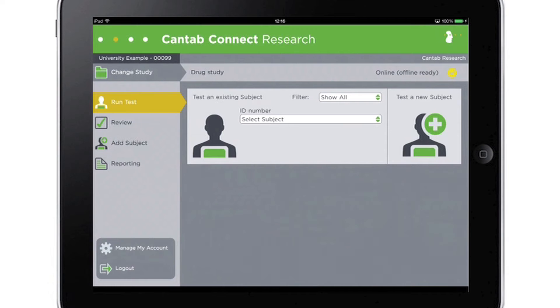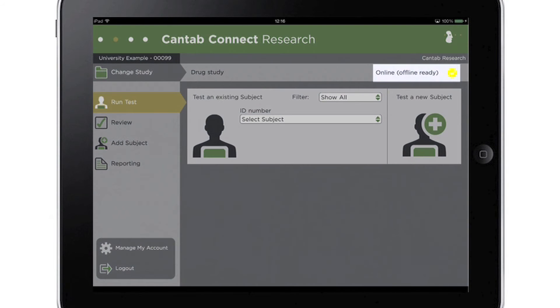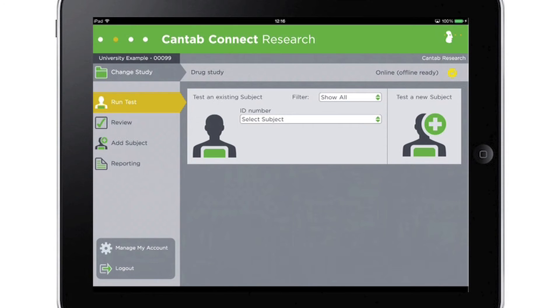All information and data is encrypted and stored securely. The home screen shows whether the device is online or offline. Data can be collected even when your iPad is offline, for example if collecting data out in the field. Cantab Connect Research only needs to be online in order to access and review data, so that all assessment data can be synchronized to ensure it is as accurate and up-to-date as possible.